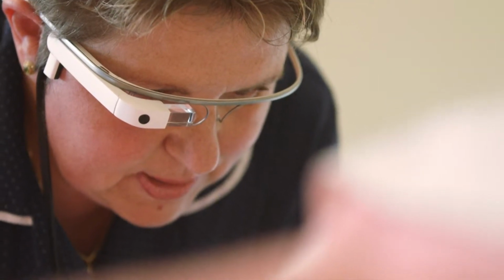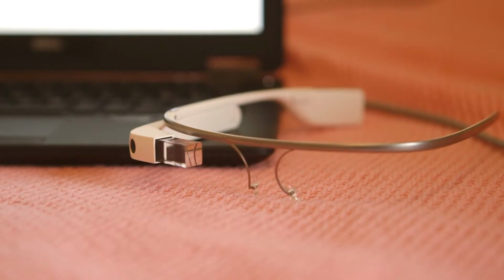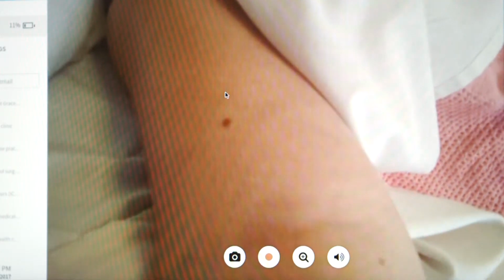See What I See is a really exciting project that we're doing in partnership with the Academic Health Science Network across Kent, Surrey, Sussex, whereby a GP can remotely assess a patient in a care home. So the care home practitioner would be wearing some head-mounted technology, which effectively are glasses with a camera built into them. And as they assess the patient, which they can do hands-free because they're wearing the glasses, that's beamed back to the GP in his practice, so he can do the assessment remotely without having to travel to the care home.